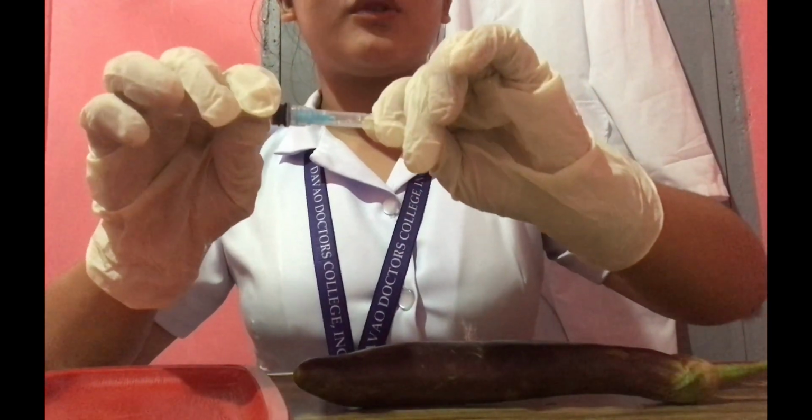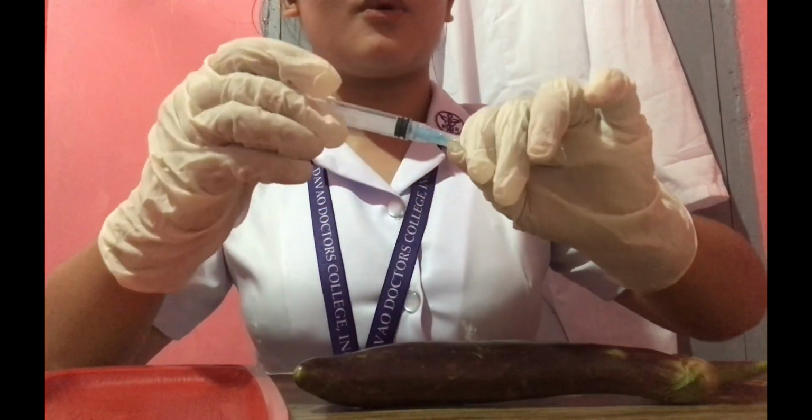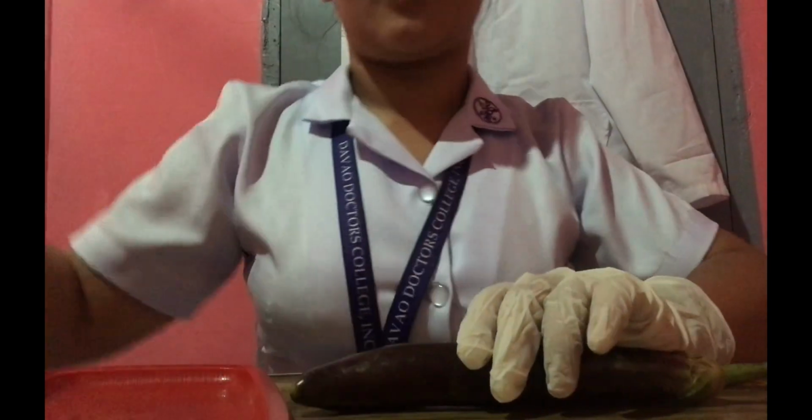Then discard the syringe into the waste receptacle to avoid needle prick injury. So, okay. Mom, we are done with your intramuscular injection. How are you feeling, ma'am? Okay, that's good. Since we're done, I'm going to let you have some rest and head out. If you need anything, just use the call button so that I'll be notified at the nurse station and come back here to attend to your needs.